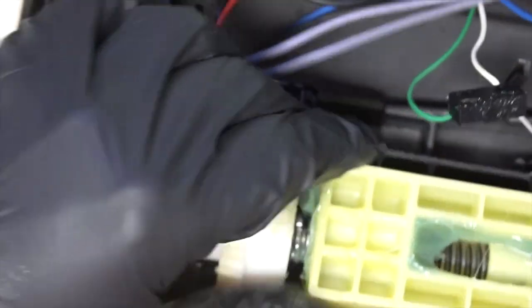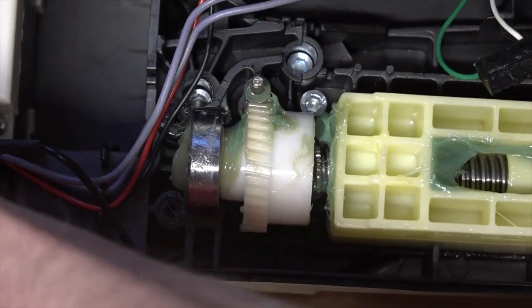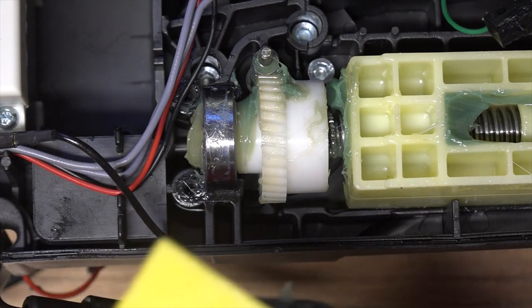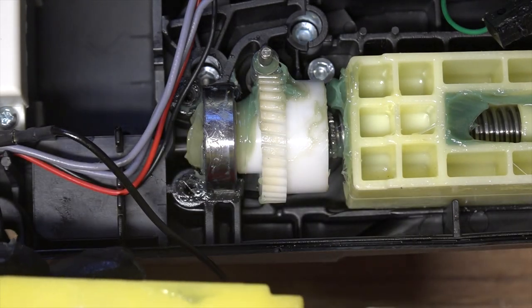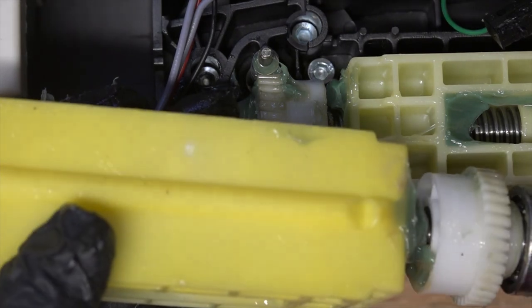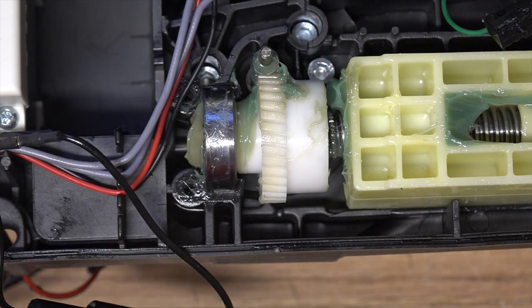No limit switch on the other side. And, of course, that's what makes it stop. It's rubbing against, let's see if we can pull one of these guys out again. It's rubbing against little divots on the side of the plastic. Let's grab this guy. And then my hands are all goopy again. It's these little divots here that control the end stop. So it's probably all wired so that when it's in the middle, both switches are compressed or active, so the current flows. And when one of the switches stops, you can't get current through that switch anymore, and away we go. So yeah, well lubed, very nice.